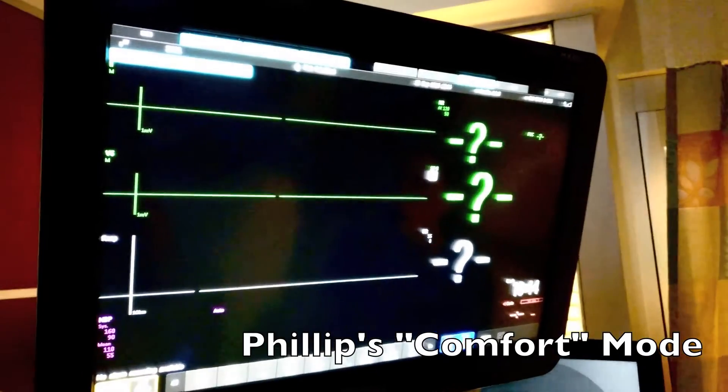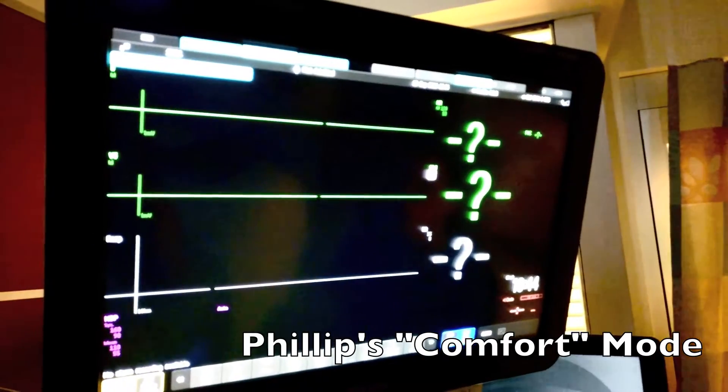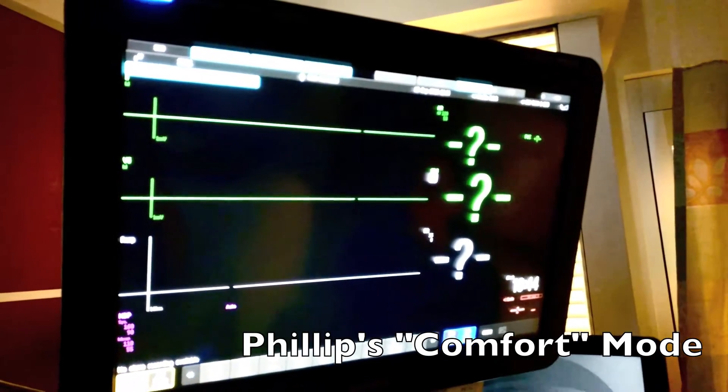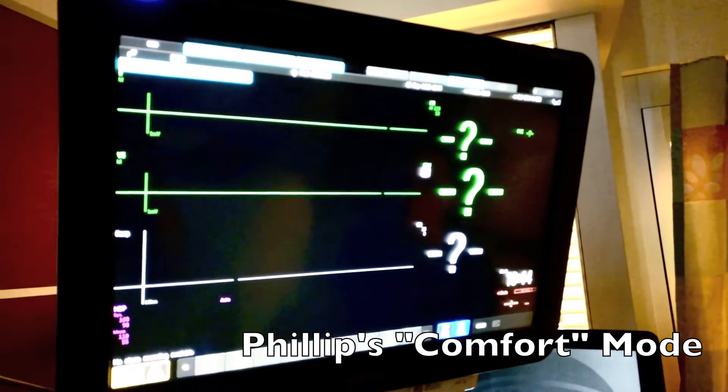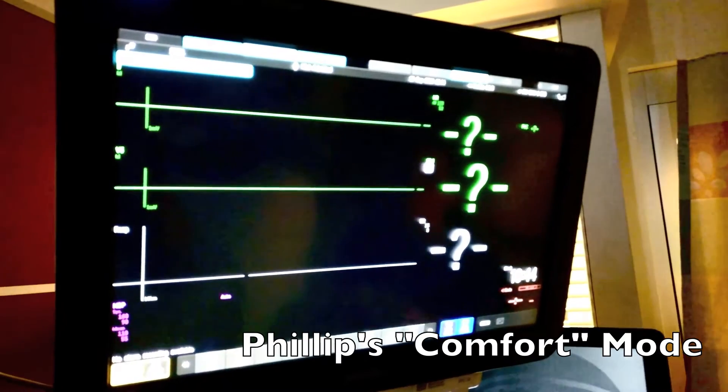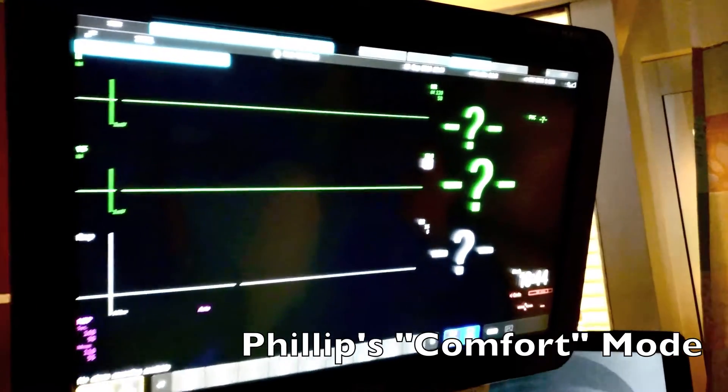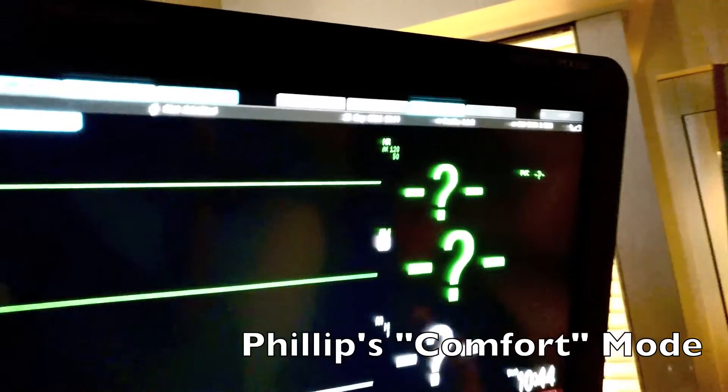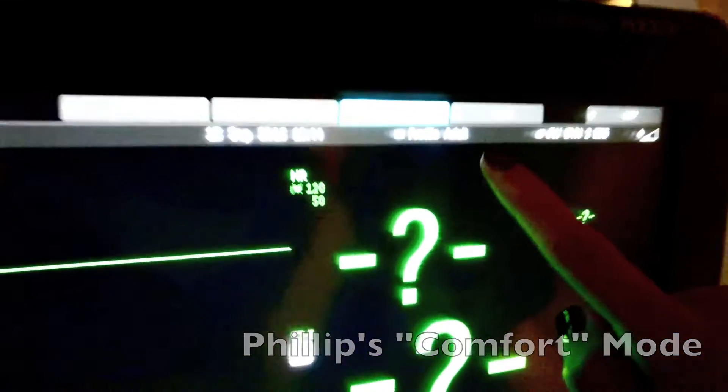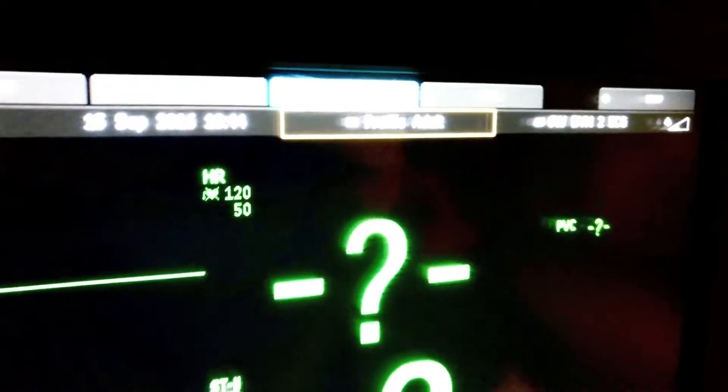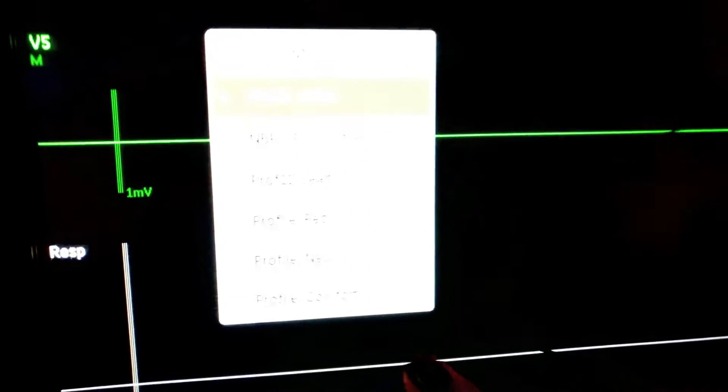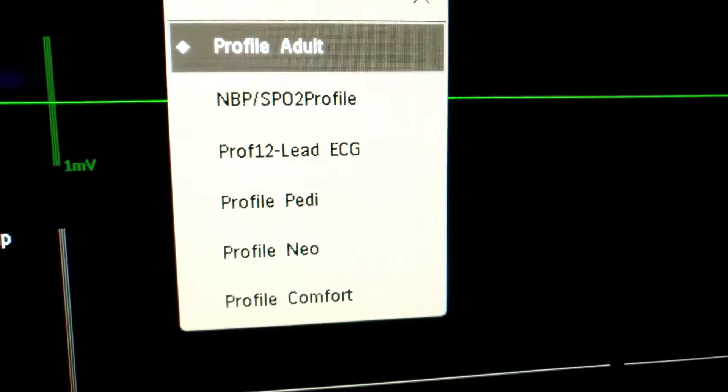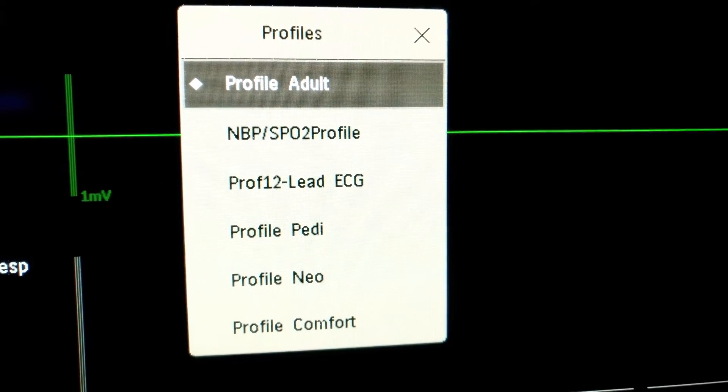In this video, I'll be showing you how to activate the patient comfort setting on the Philips Critical Care monitors. Comfort mode can be utilized to silence all alarms in a patient's room and can be used to encourage patient sleep and limit patient anxiety.